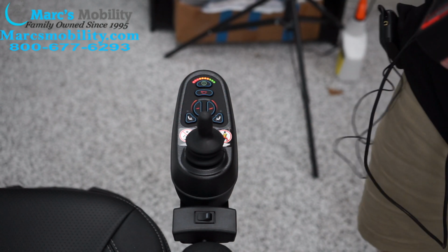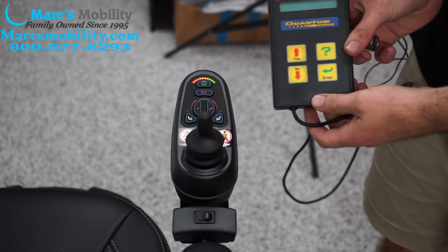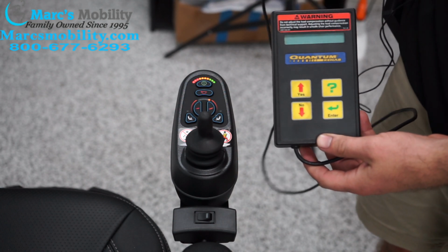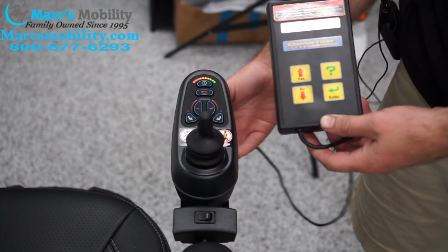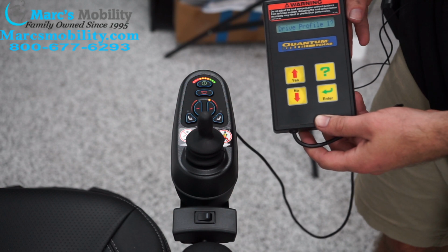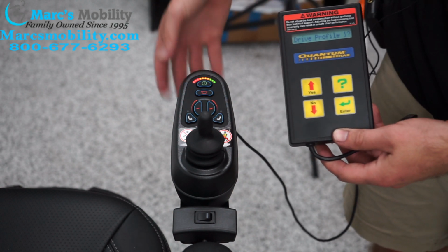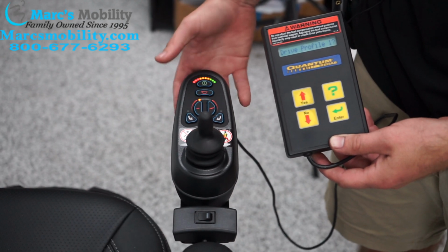Today I'm going to show you how to program a Jazzy Air 2 joystick. So we start with our programmer. It looks like this, and you will plug it into the same place that you charge the chair, into the charging port. And then the programmer will automatically turn on. Now, this light is only blinking because I have the seat lift up to make this video easier to film.